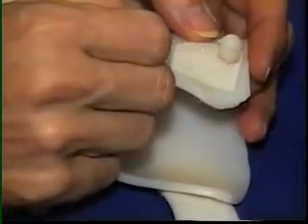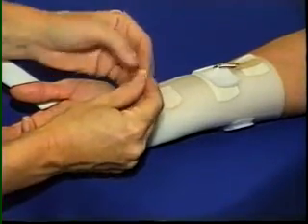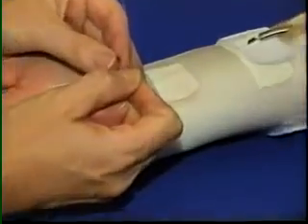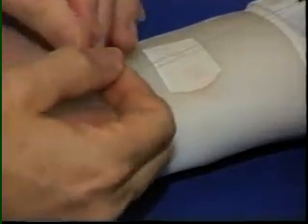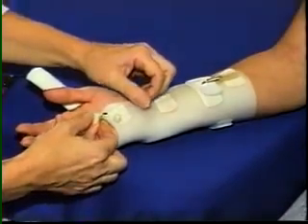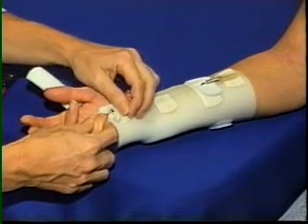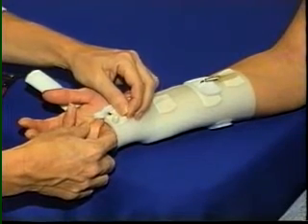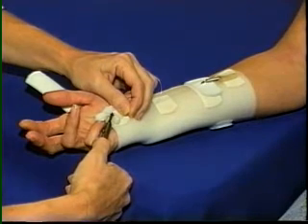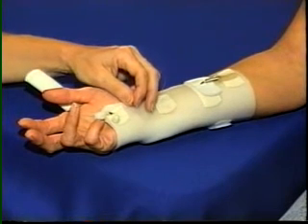A nylon line is threaded through the line guide, then through the hook velcro. The line is then threaded through the line connector and attached to the nail. The desired length is determined, and the line is secured with a line connector, or a Fisherman's Knot may be used. The line is attached to the dynamic component of choice. The result is a low profile and low friction pulley.